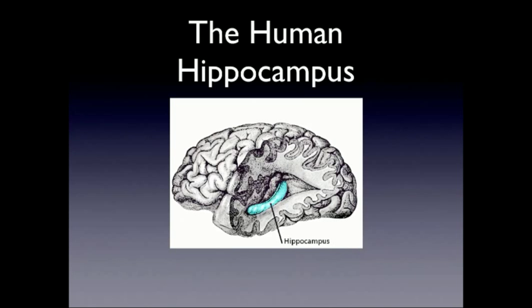So a good example of this is the hippocampus. This is an example. It's a truly 3D structure. It's got a difficult shape. It's on this kind of oblique angle and it curves around. It's a deep brain structure, so it's hard to get a good automatic segmentation. So there's a lot of work. A lot of people wind up having to do this manually.